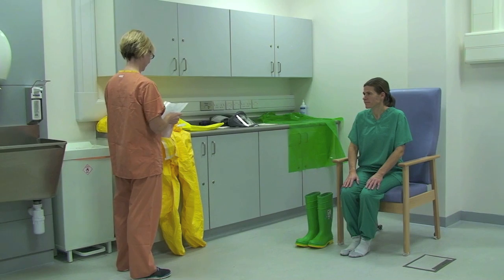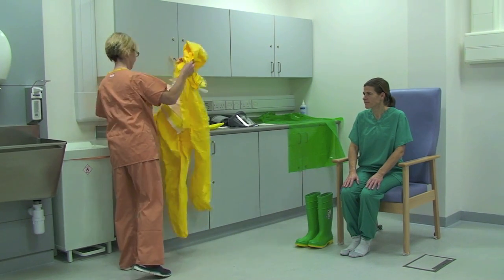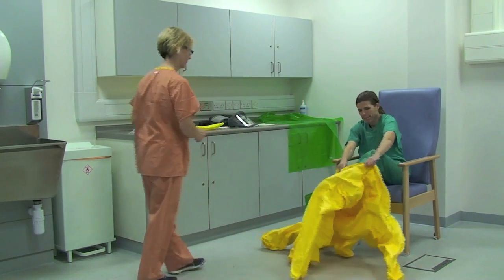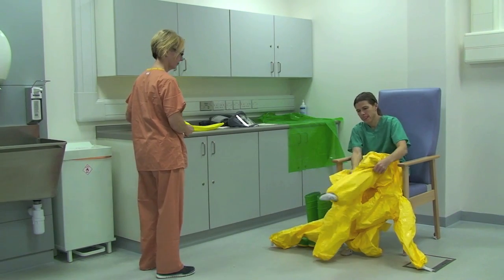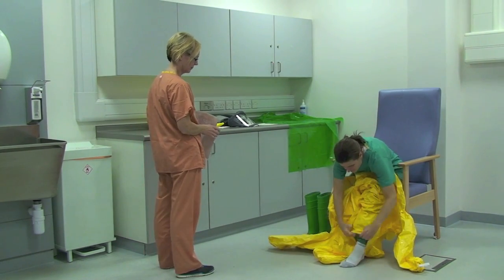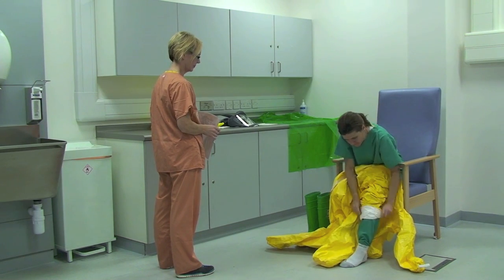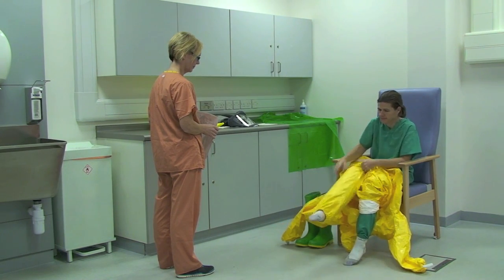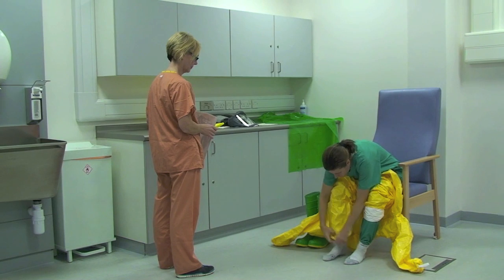As you may be in PPE for some time it is important to drink some water and visit the toilet before donning. Wearing scrubs, the healthcare worker puts on the coveralls rolling them up to their knees. This may be easier while sitting down. The buddy will assist the healthcare worker using the aid memoir.